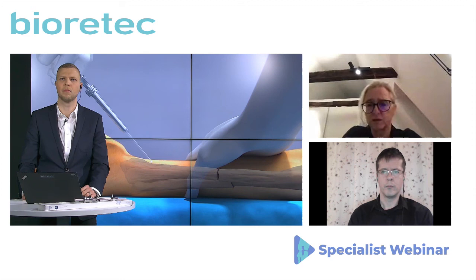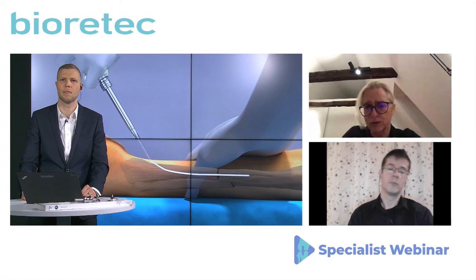I can only comment that adult surgeons have discussed this for years. If you have a fracture, you get something out every time. You do not have this osseointegration, because that is not the problem. What you have is that the bone is still growing and it overgrows. So it's not so easy to remove it. Up to 1 year it's easy, but then it becomes more demanding because it's growing. So it's in the canal and you can't open it easily to get it out.